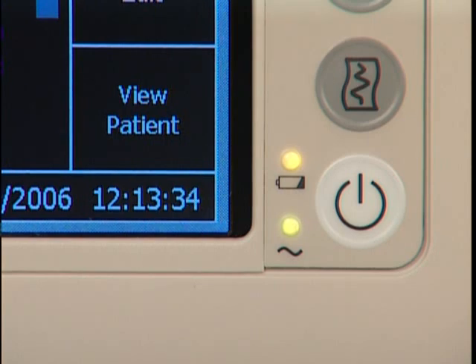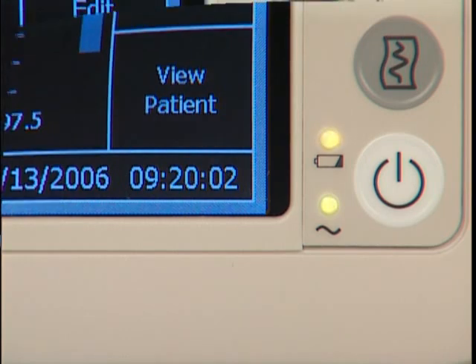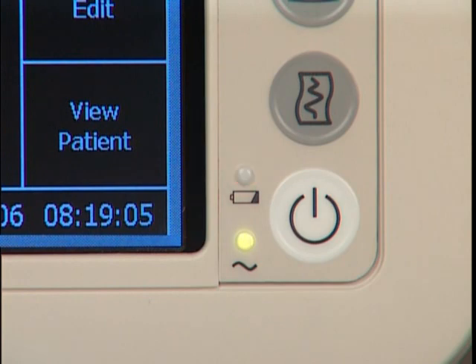Steady green indicates that the battery is fully or almost fully charged. Flashing green indicates a medium charge level. Yellow indicates a need to charge the battery.